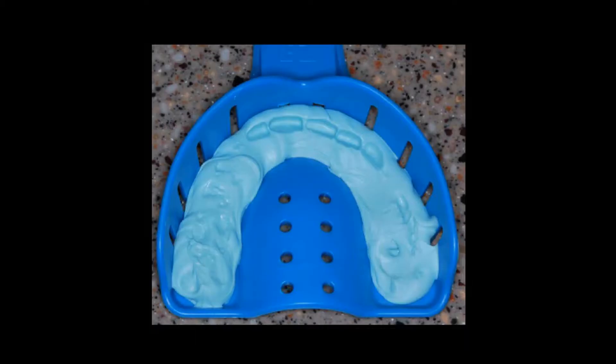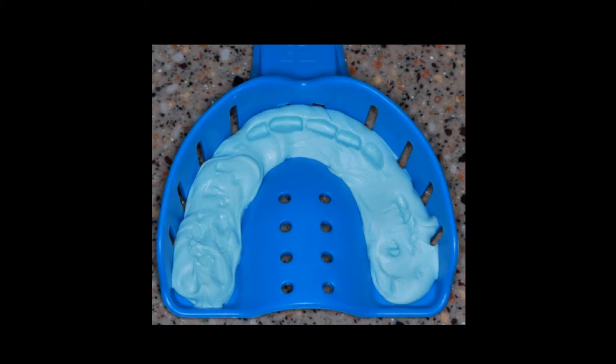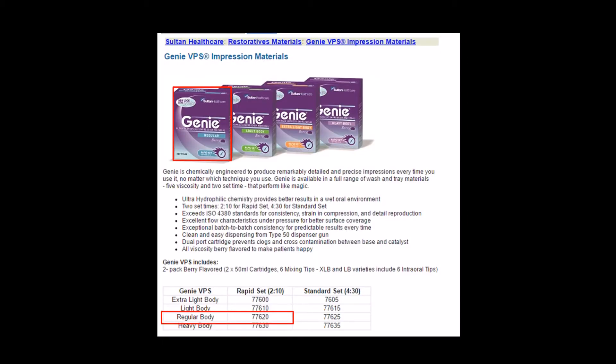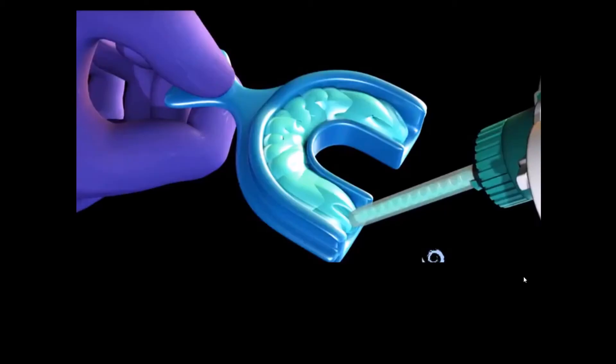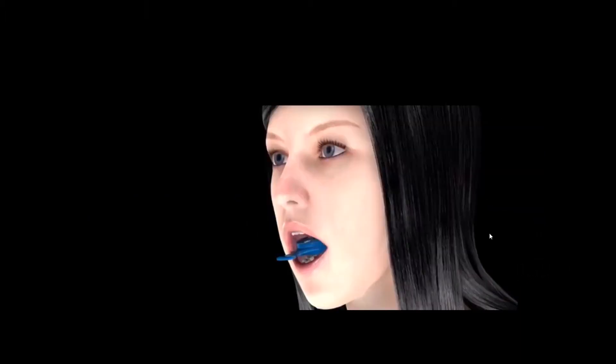Add some bite registration material and place in the mouth to index the teeth and to ensure no areas of the tray show through the impression material. Sultan Healthcare Rapid Set Regular Body is the recommended PVS material. Fill the impression tray with PVS material ensuring that the material fully covers and surrounds the teeth. Take an impression, the teeth should not touch the impression tray.